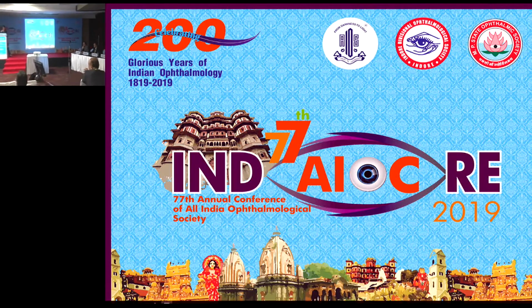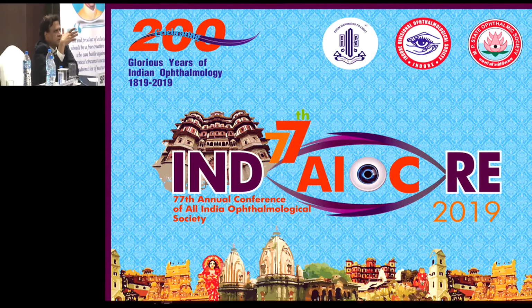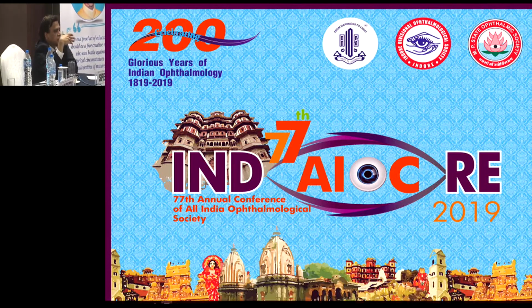I think strongly that fluorescein is there to stay for some time at least, and OCTA has limited value right now, so edema and all that stuff you have to see with fluorescein. And you'll have a pan OCTA, like stitching up the images like the Zeiss is doing, and that also interpretation will be difficult. There are a lot of artifacts also with OCTA. So till such time, fluorescein would be staying, and wide field also.